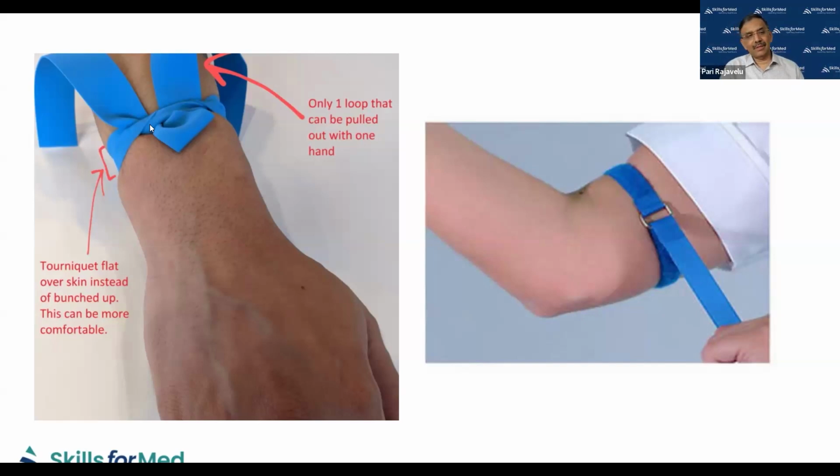Yes, I think most of the time we don't have a tourniquet like this in India without Velcro. Most of the hospitals have Velcro, and these come in different strengths. Some of them come off easily, some are very sticky with too much adhesive. So we need to choose the Velcro which can be easily pulled. Small things, but I think these also matter.